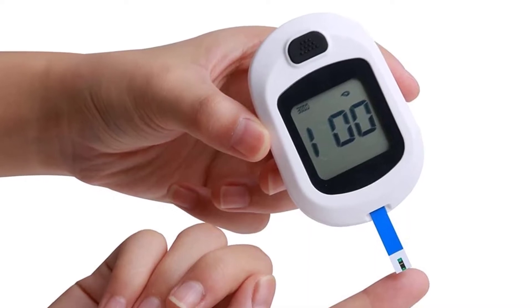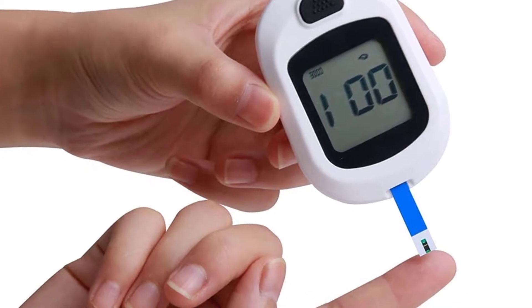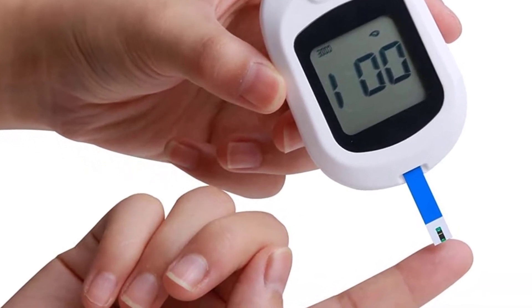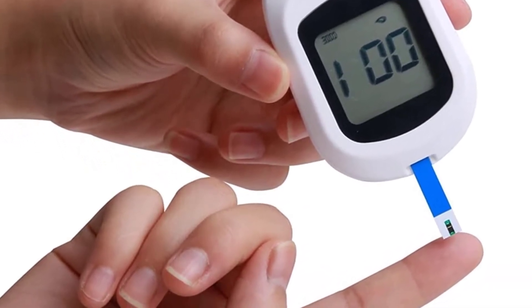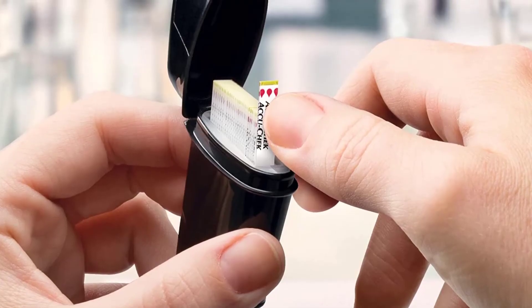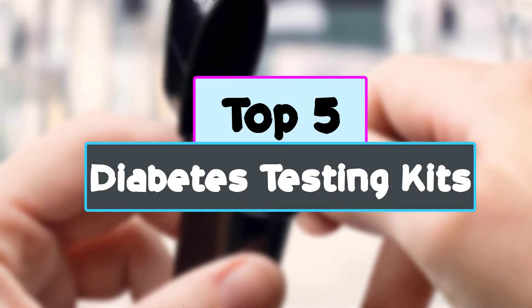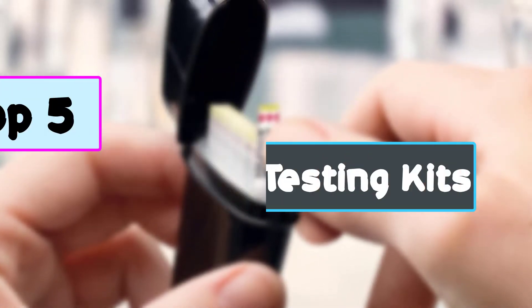Living with diabetes isn't easy. It's a chronic disease that requires much care and observing vital health measures to live a healthy life. It's also a tricky illness that one can live with for long without knowledge before diagnosis. In this video we're checking out the top 5 best diabetes testing kits for you right now available on the market.